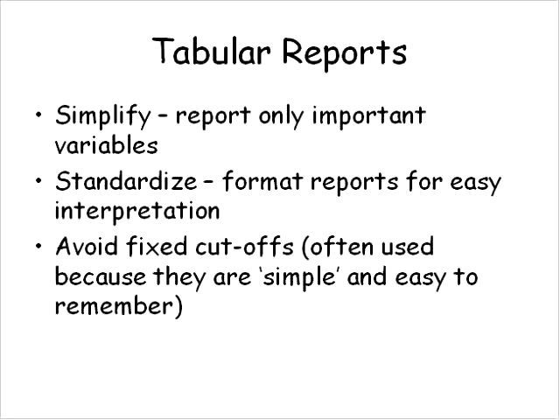However, there are some references to various different studies that suggest one way may be better than another. However, nothing has been put down in concrete. I think it's important to keep in mind that if you're using a gas dilution technique like the nitrogen washout, where the patient's given 100% oxygen to breathe for several minutes, you probably don't want to do that particular maneuver immediately before performing a DLCO maneuver. The ATS guidelines do recommend that the patient using oxygen be taken off that oxygen for at least 10 minutes before doing the DLCO maneuver to allow their blood gases to normalize. So again, there's probably not a lot of literature to support whether or not that really has an effect, but these seem to be common sense types of issues that probably should be taken into account.